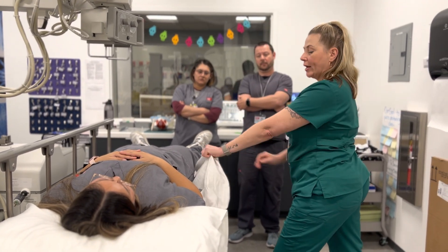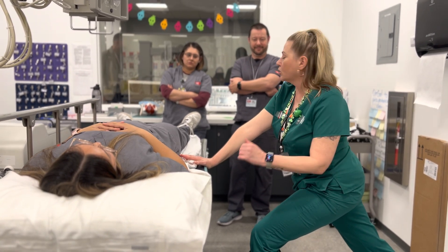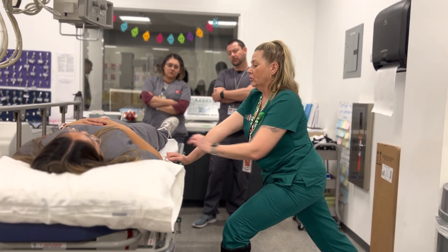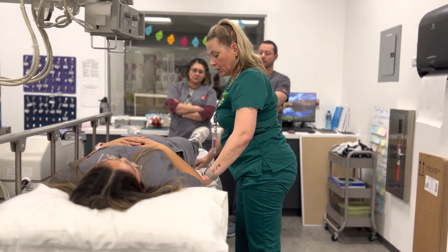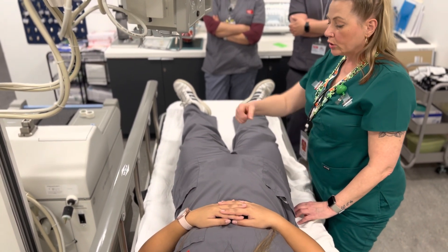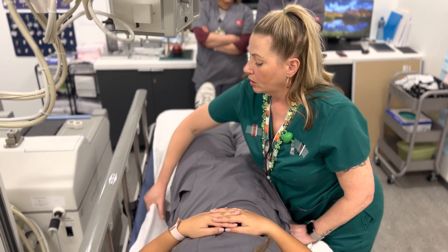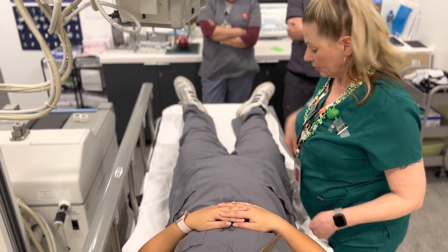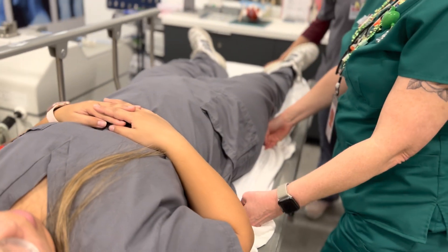Then I change to one hand — one hand holds the sheet, dominant hand is going to be pushing the IR. I go in the center of the IR and get into my stance: one knee bent, one leg straight. This arm is my lever, so this arm has to be straight — no bending. I pull with the sheet and push at the same time. Once it's in as far as it needs to go, I check that it's even on both sides. I'm also going to check that my patient isn't rotating. If they're tilted one way, I pull the sheet on that side to even out the hips. Then I tuck the sheet in so I can see where I'm at.